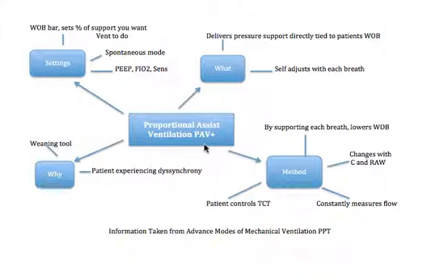If we look over here at maybe why you would use this, you can use it as a weaning tool because it's a spontaneous mode. You can also use it if the patient is experiencing a lot of dyssynchrony with the vent. It's also a good one to use for that. So that is it for this mode.